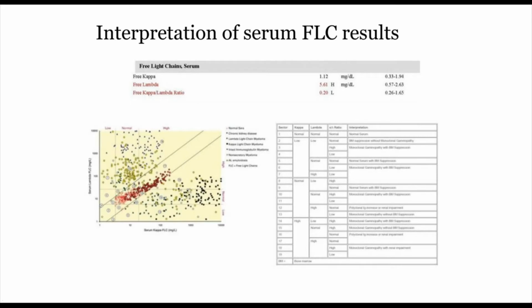So even though a result may be outside the AMR, the machine might potentially falsely detect it as within the AMR by antigen excess. And so we believe that the results that we got probably were outside the AMR. It just wasn't detected as being outside the AMR because it didn't have the safety mechanisms in place to prevent the machine from letting a result through without recognizing the potential antigen excess.